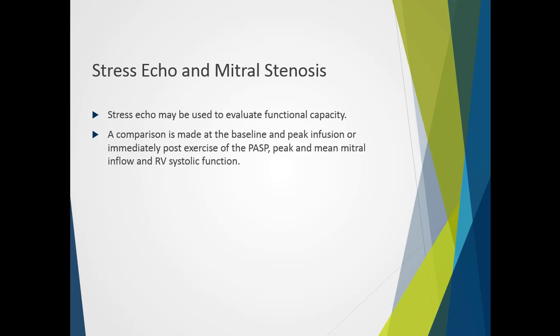Post-exercise imaging will assess the pulmonary artery systolic pressure, the peak and mean mitral inflows, and RV systolic function. Marked increases in the pulmonary artery systolic pressure and decreases in RV systolic function further indicate the valve is significantly problematic.